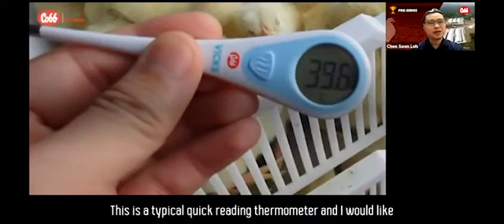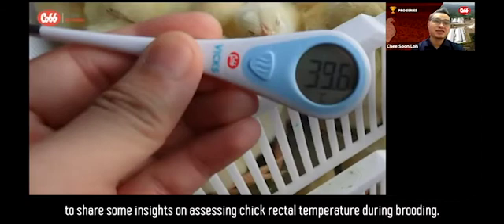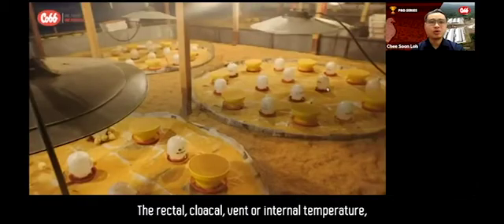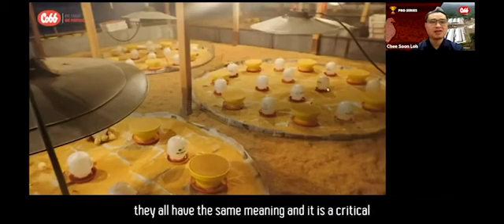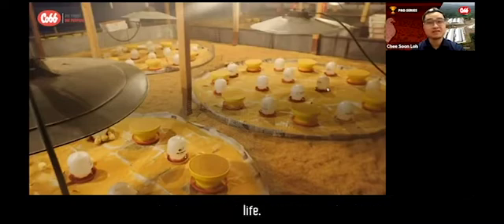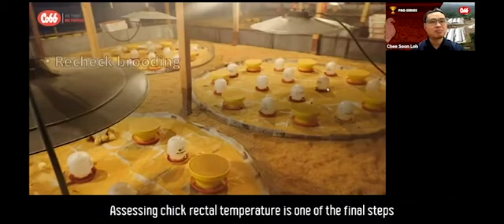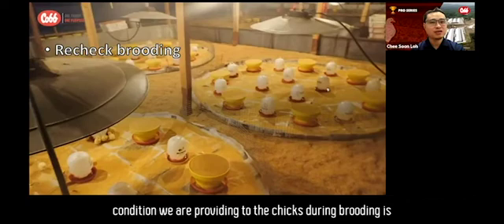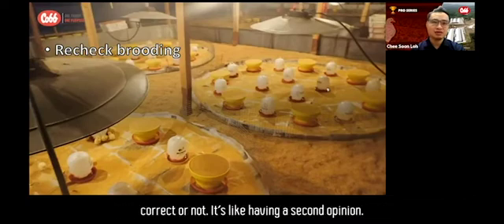This is a typical quick-reading thermometer, and I would like to share some insights on assessing chick rectal temperature during brooding. The rectal, cloacal, vent, or internal temperature — they all have the same meaning, and it is a critical parameter to assess in the first three to four days of the chick's life. Assessing chick rectal temperature is one of the final steps we can take during brooding to check whether the conditions we are providing are correct or not.